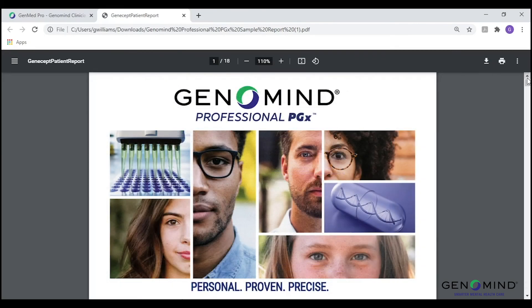I hope this overview has been beneficial in further exploring all that the Genomind Professional PGX Express report has to offer. For more information on our product, please visit Genomind.com, and for further questions or information regarding the interpretation of a report, please schedule a clinical consultation with one of our medical science liaisons or utilize our on-demand clinical hotline. These services are provided with every test, so whether you have a quick question or need to go more in-depth, our team is here to help.